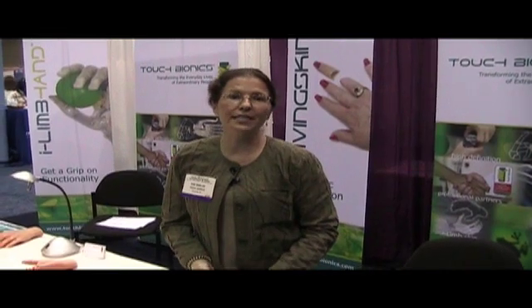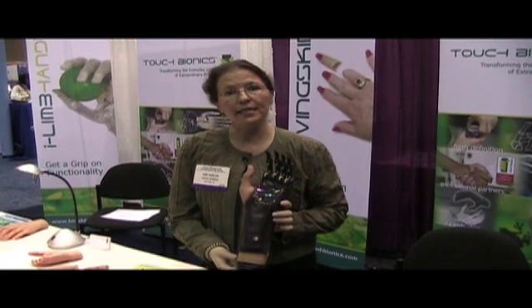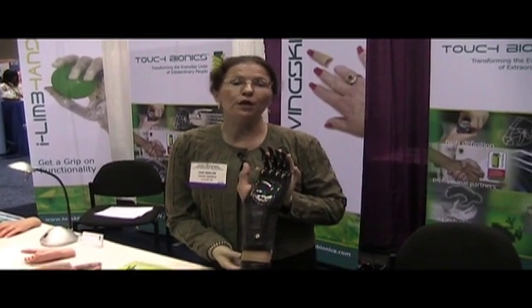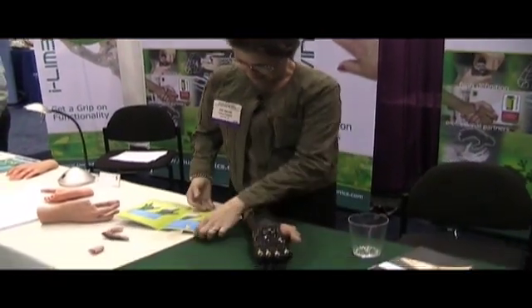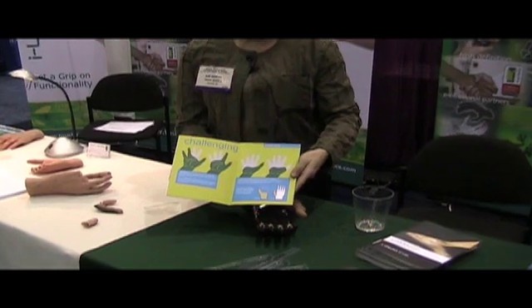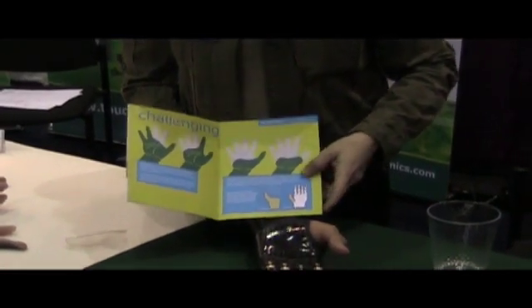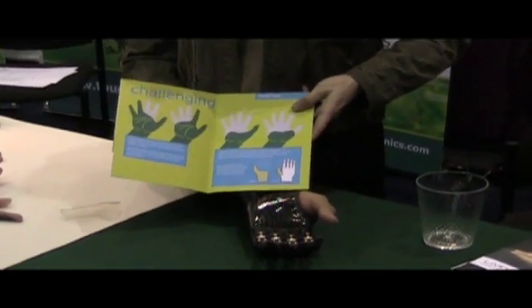One of the other prostheses that Touch Bionics makes is called ProDigits. It's a partial hand prosthesis that has electrically powered fingers. We can make anywhere from one to five electrically powered fingers for somebody who's had a through-the-hand amputation. If their amputation was at one of these levels, we could fit them with electric fingers. This is the first prosthesis with that ability that is available for patients to wear and bring home.